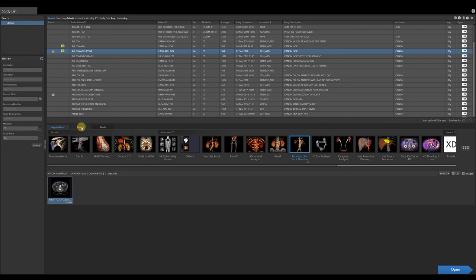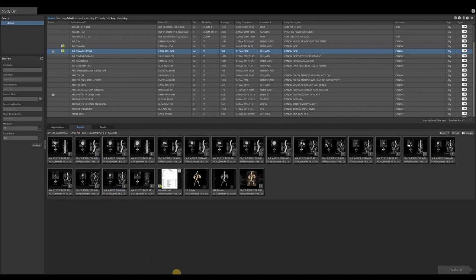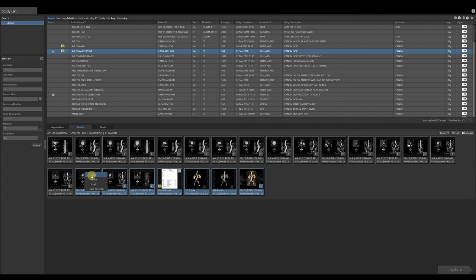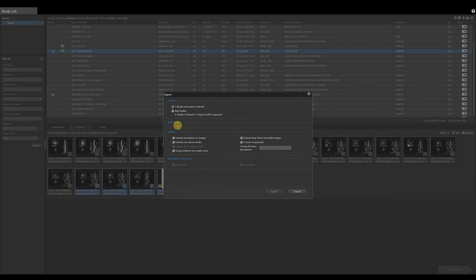To see evidence saved, go to the Results tab next to the Applications tab. To save any saved evidence and send back to archive, use the Control button and single left-click on anything needing to be sent to archive. Right-click on any of the highlighted images, select Export, select the destination, then click the Export button.